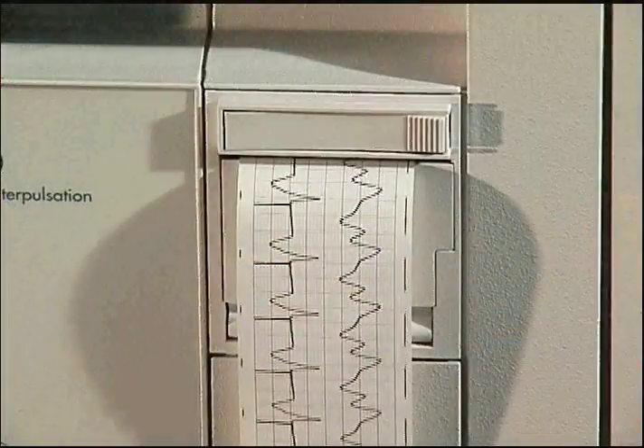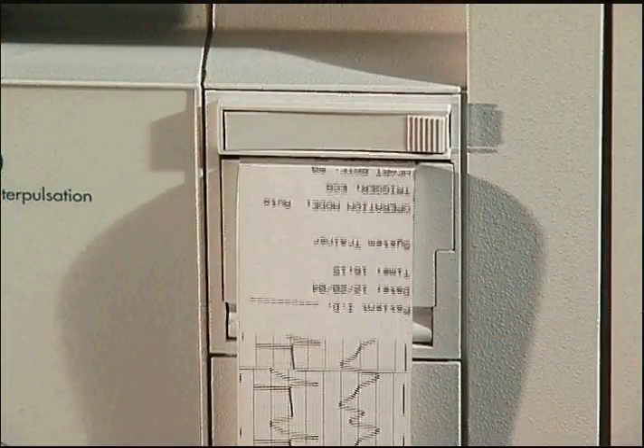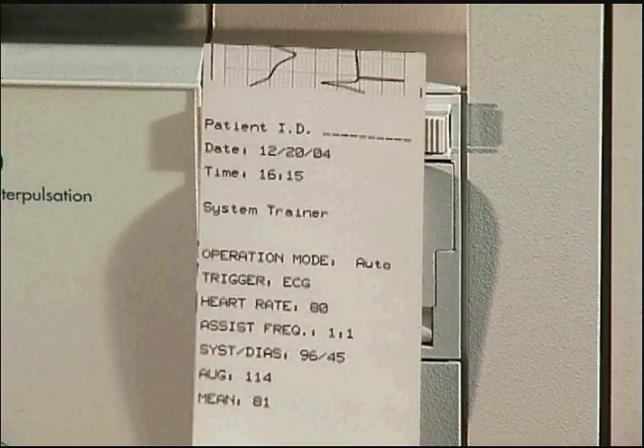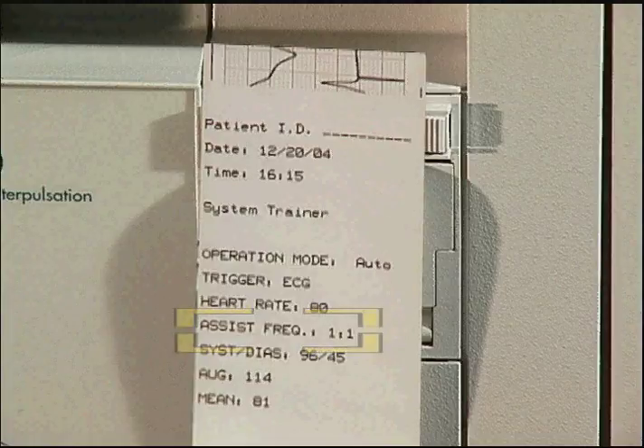At the completion of the recording, an annotated trailer is appended to the print. The annotation describes patient and system status. The format of the annotation depends upon the IAB assist frequency selection.